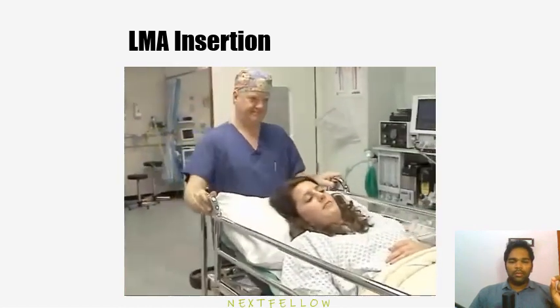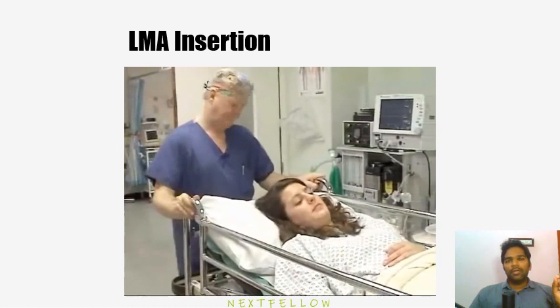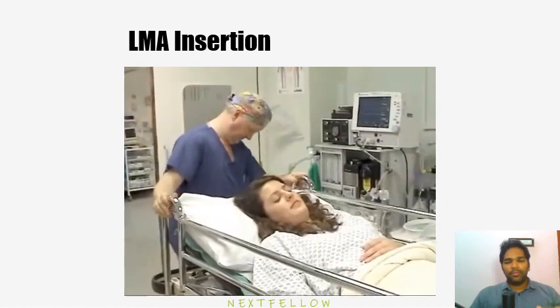Before that, I want to tell you something. In anesthesia practice, LMA is also used for patients needing a small duration surgery, a minimal duration surgery, or a daycare surgery. In these patients, LMA is much better because if you intubate, you need to paralyze the patient and keep the patient on a ventilator during the surgery. With LMA, you can just sedate the patient, insert the LMA, and leave the patient to breathe for themselves, on spontaneous ventilation. That is why in daycare surgeries, LMA is preferred over endotracheal intubation. Now we'll see the video.